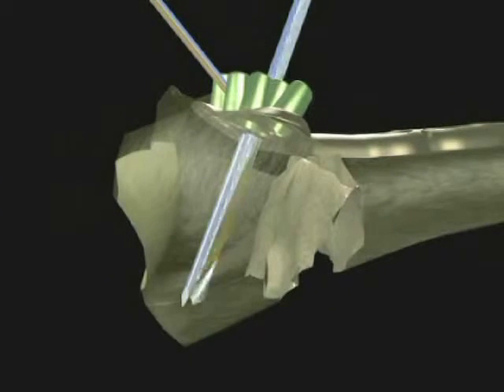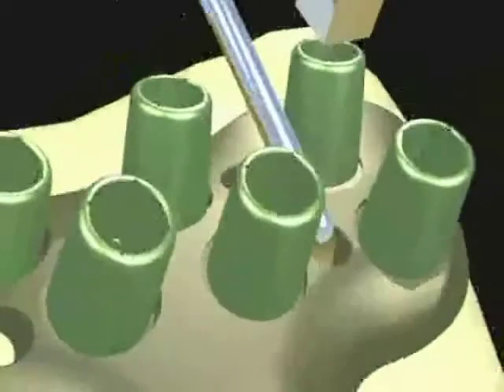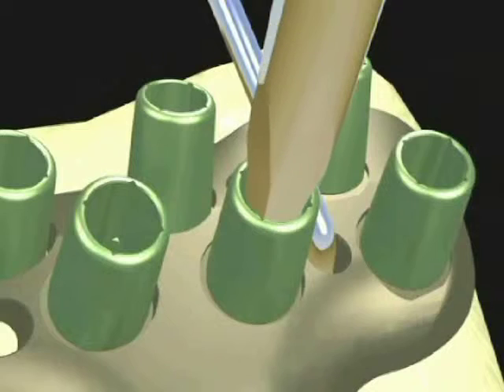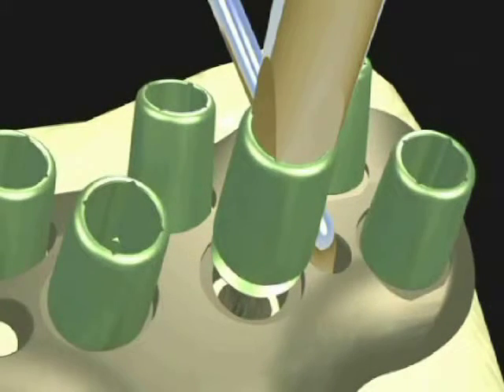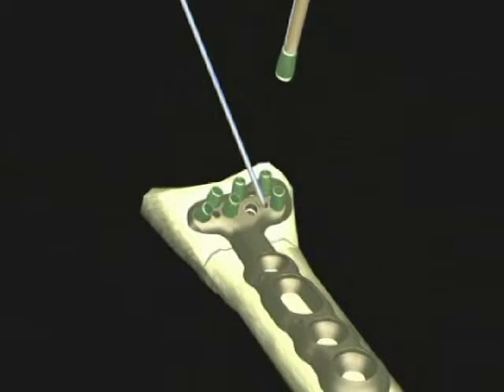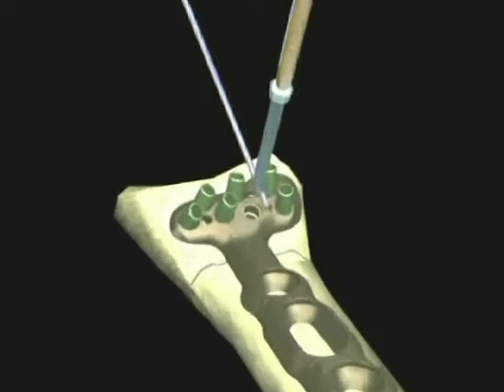Drill through the preloaded single-use fast guide using the 2 millimeter fast drill bit. Insert the fast peg driver into the fast guide until fully seated, and then turn in a counterclockwise motion to remove. Dispose of the fast guide after removal as they are intended for single use.